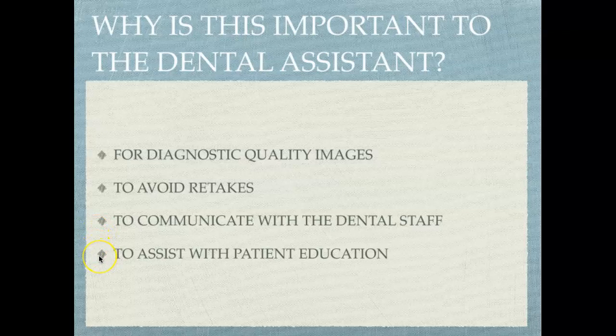And sometimes it does assist us with patient education if a patient is asking us about certain conditions on an x-ray. Again, you don't want to be diagnosing, but if a dentist or a hygienist has already explained that to the patient, sometimes the patients still have questions. And depending on your dental practice, you may be the one to answer those questions for the patients.